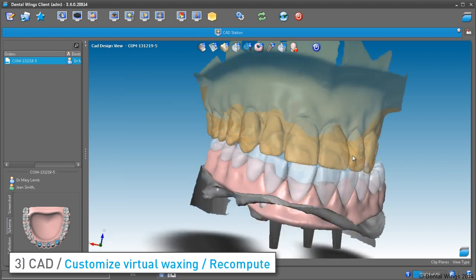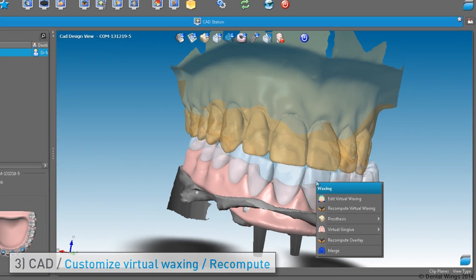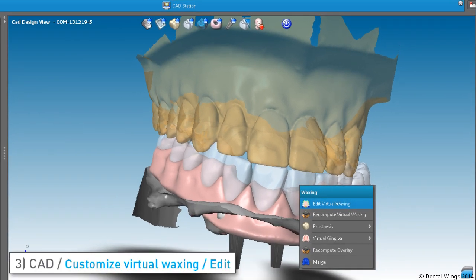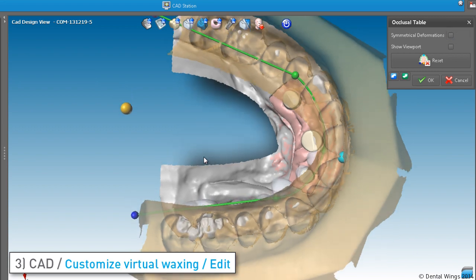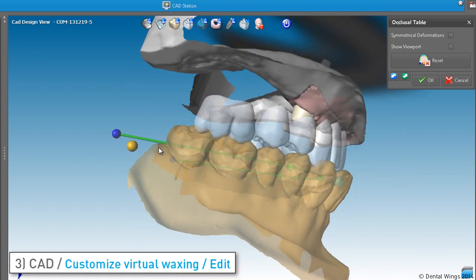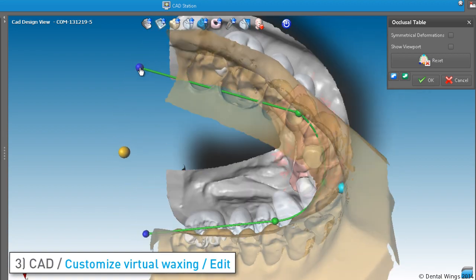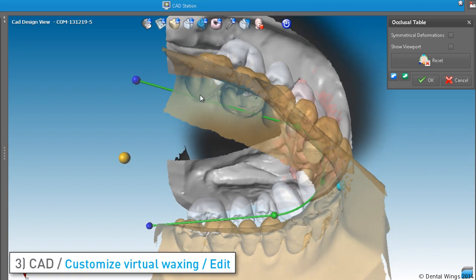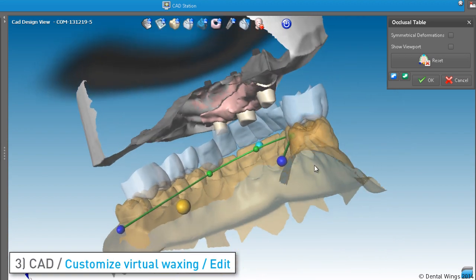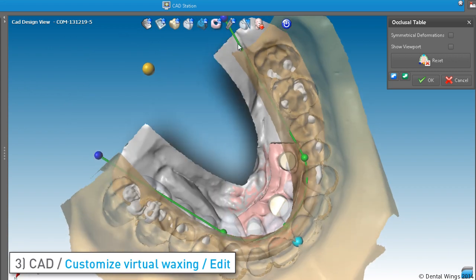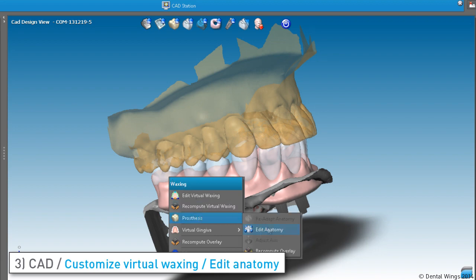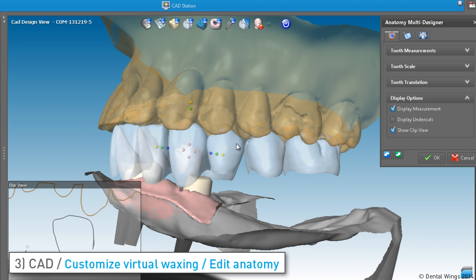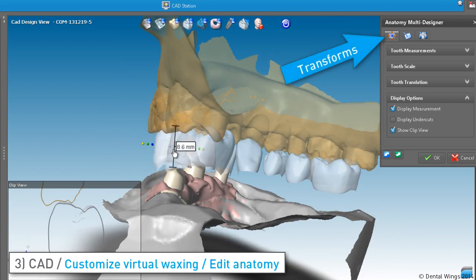The virtual waxing may need adjustments. Here are the available tools. Using the Edit Virtual Waxing function, you are given an arch with handles to reposition and shape the virtual waxing. The Edit Anatomy function lets you use the shaping tools on every tooth, such as transforms, as seen here.